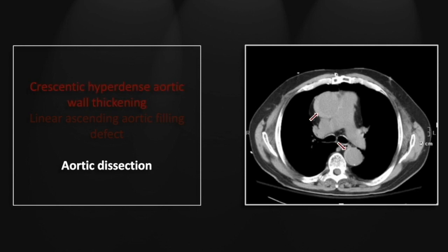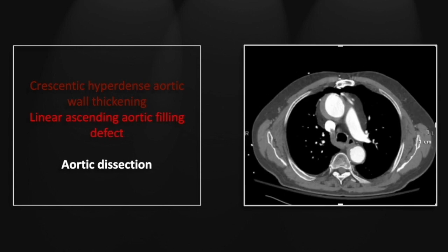There is a crescentic hyperdensity adjacent to both the ascending and descending thoracic aorta. On the contrasted study you can see the now relatively hypodense crescent distorting the ascending aorta, and the all-important dissection flap is visible on its anterior aspect, with a small bit of focus within the aortic media outlining the back aspect of that dissection flap.